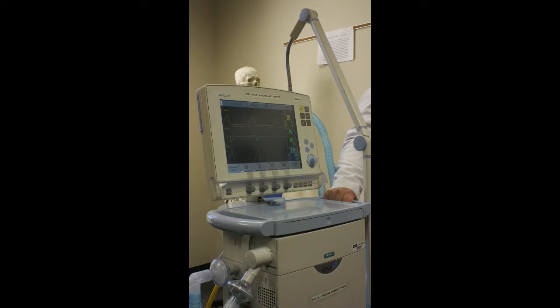So remember, in assist control, what happens when our patient initiates a breath? Then assist control cycles on. It'll deliver the set volume or pressure. So there is no breath to even use pressure support on. So we would be saying NA. Pressure support can only be in SIMV or just plain old pressure support.